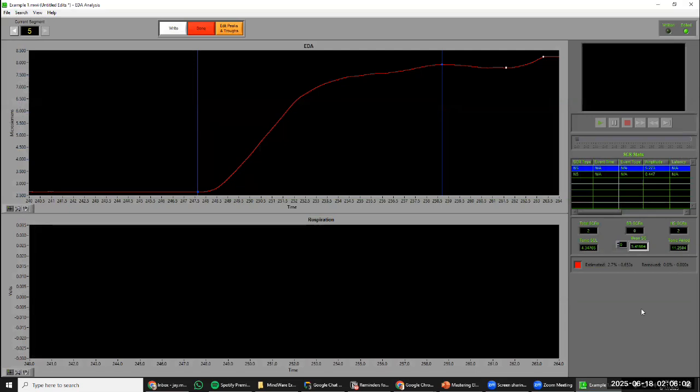Now, in doing these kinds of things, we just want to be aware that if we are doing SCRs, let's really try to minimize the amount of time that we're extending or extrapolating, estimating these data, so that we don't dramatically underestimate SCRs. And it's also the case that we might want to consider that tonic information and whether we're going to use it or not. But again, for mean skin conductance level, this sort of procedure up to about 40% of a segment is normally safe to do.